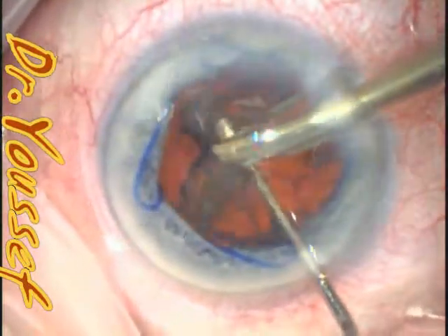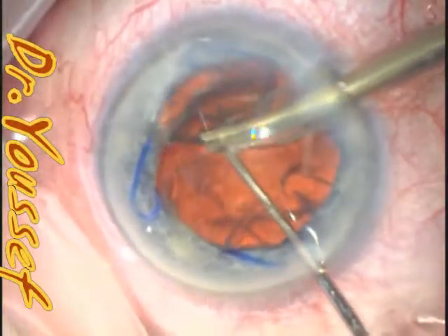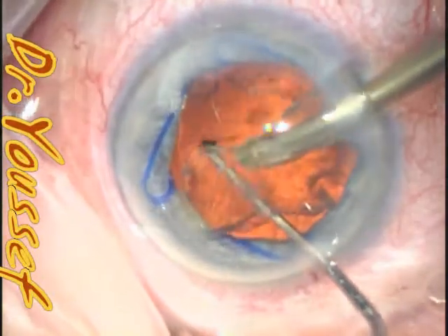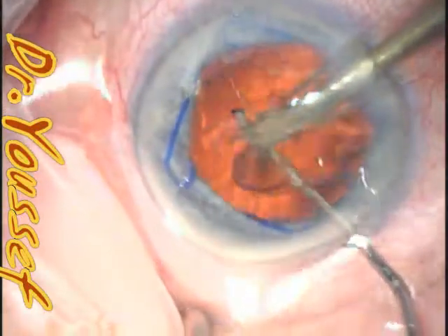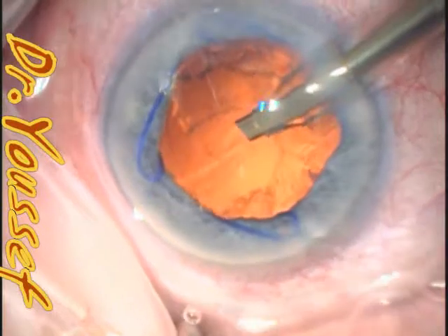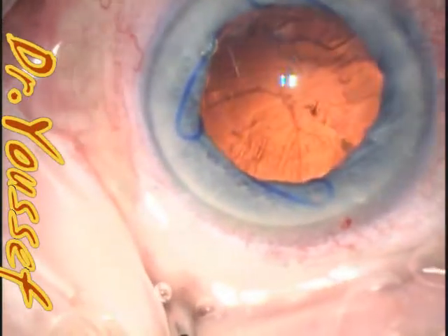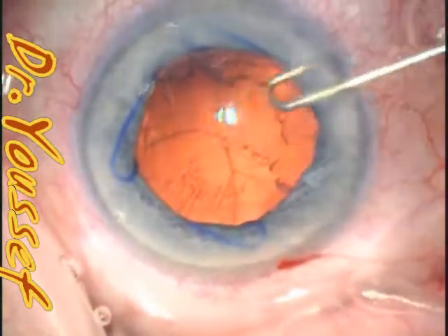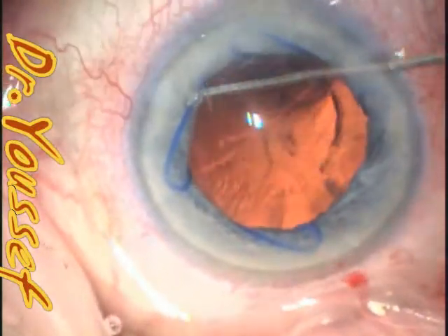What happened in this case is that the tip of the J-Cannula was actually on top of the capsulorhexis or capsular bag, and it resulted in hooking the capsular bag, and that resulted in a very small dialysis.